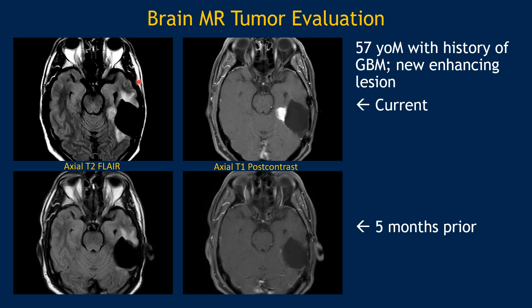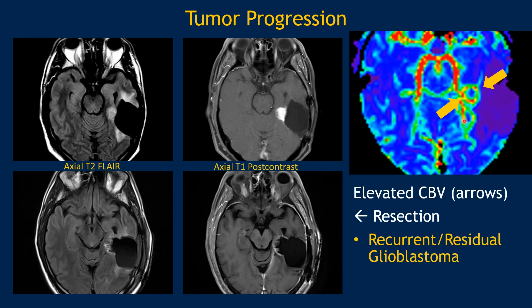In brain tumor imaging, conventional imaging may only show a nodule in the left temporal lobe five months after mass resection. This nodular enhancement was not there before, and in conventional imaging it may be very difficult to tell whether this truly is a recurrent or residual lesion versus treatment or radiation effect. However, DSC perfusion imaging shows that same enhancing nodular lesion has elevated blood volume, shown here in red. This was surgically removed and pathology confirmed recurrent or residual glioblastoma — the perfusion was very helpful in assisting diagnosis before surgery.